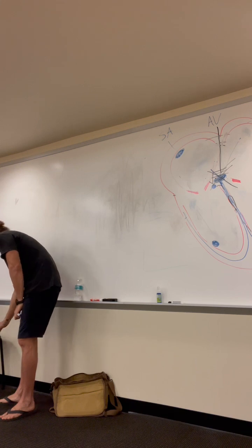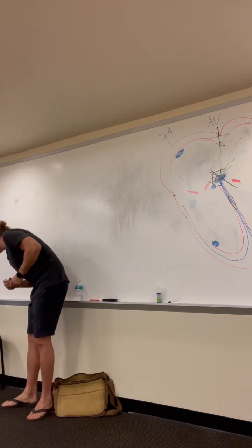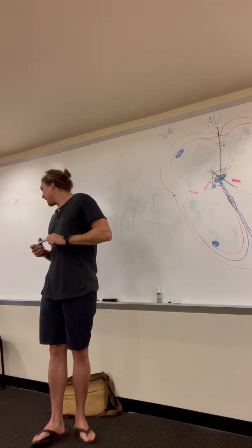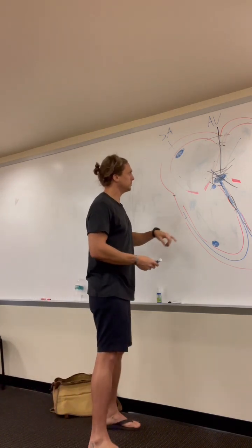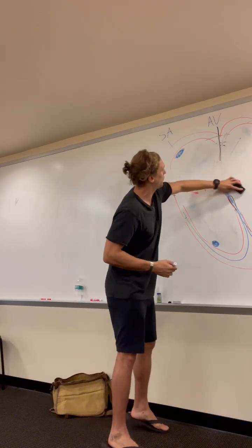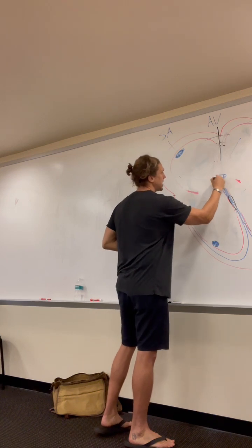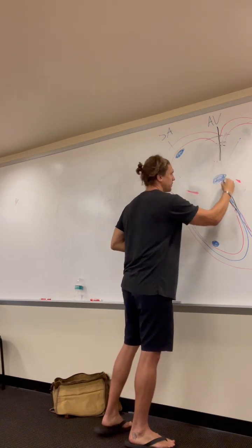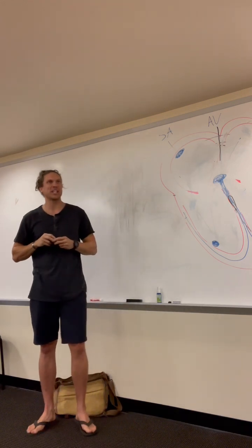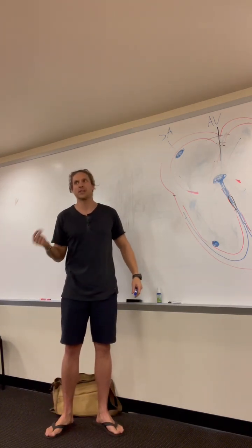All right, so v-tach is our next one, slide 15. So in ventricular tachycardia, there is a focus down in the ventricles that has decided it's gonna take over pacing. And that could be for a bunch of reasons. The person's about to die, and the ventricles are like, okay, I'm gonna try to fix this.